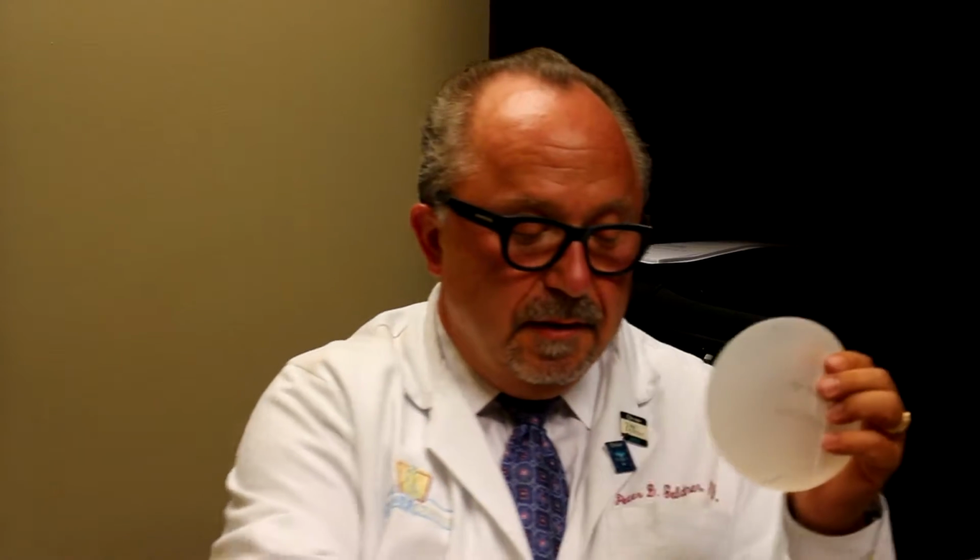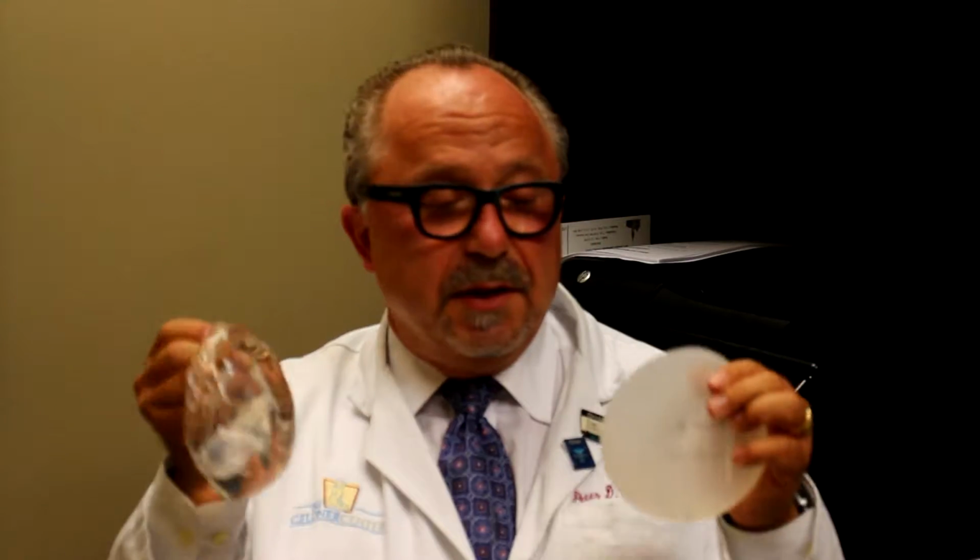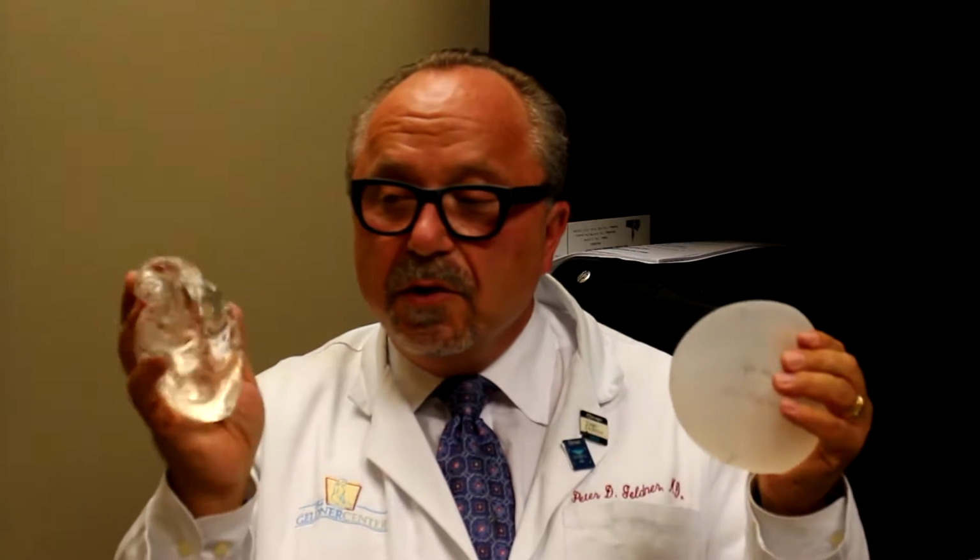What's a gummy bear implant? This is a gummy bear implant. This is not a gummy bear implant. Both of these implants are made by Mentor Corporation. It's a very good company that makes wonderful products. But we can see a few differences right away.